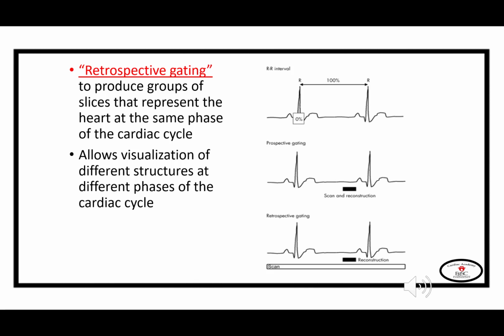however, it comes at the expense of increased radiation exposure to the patient. The other technique, what we call prospective gating, as we can see in the middle part of the image, is simply we do the scan, the X-ray exposure and the acquisition in a selected phase of the cardiac cycle, and this usually occurs in the mid-diastole.